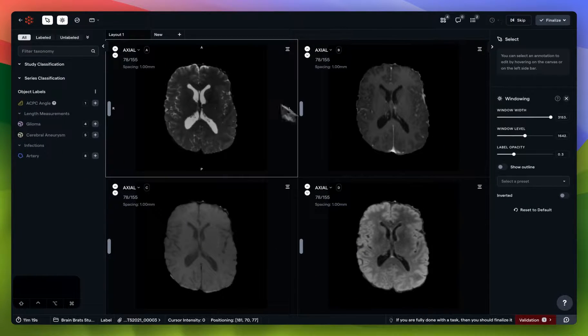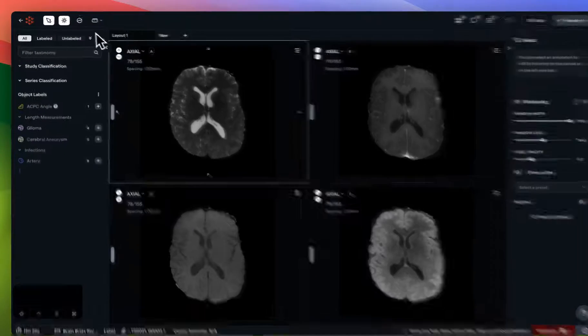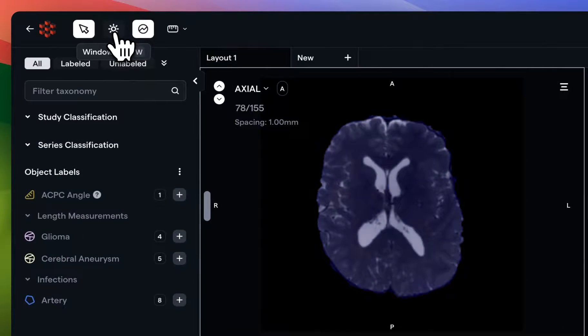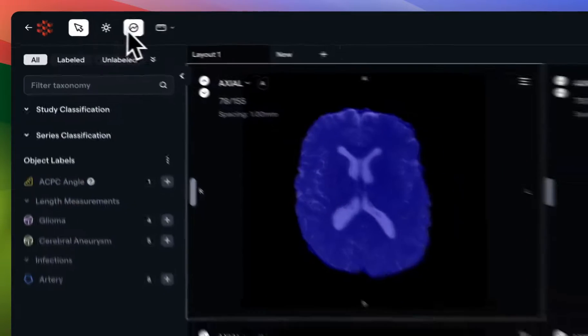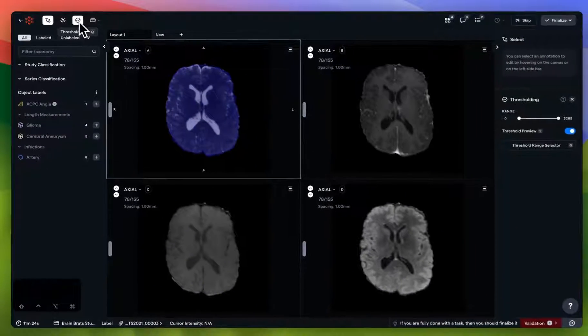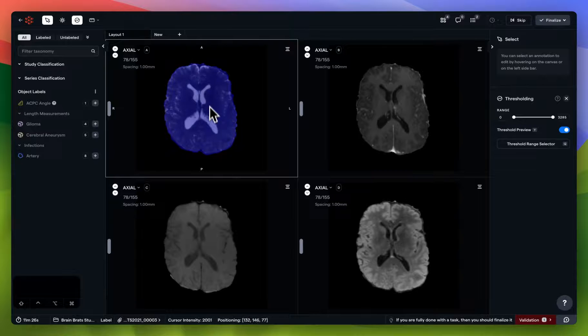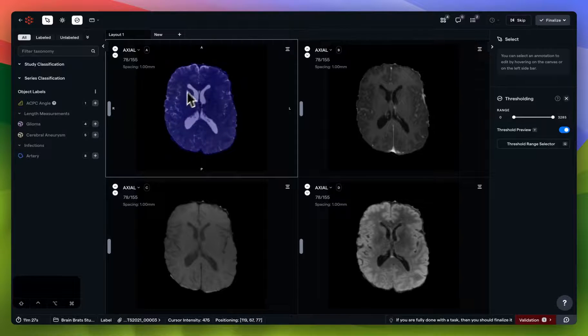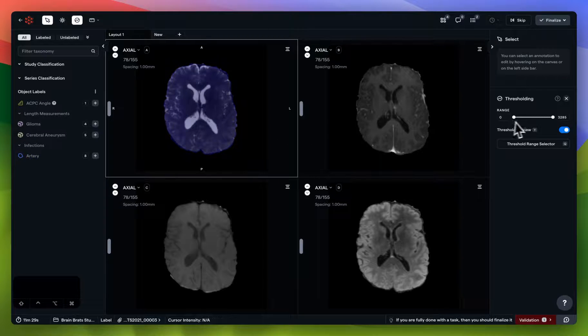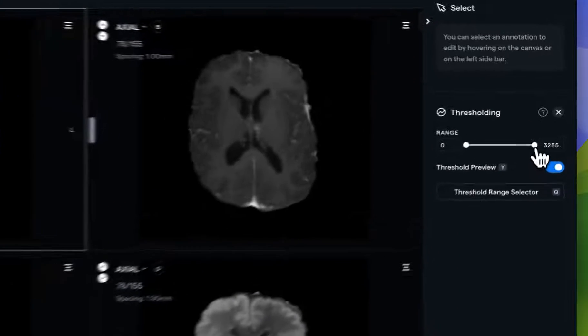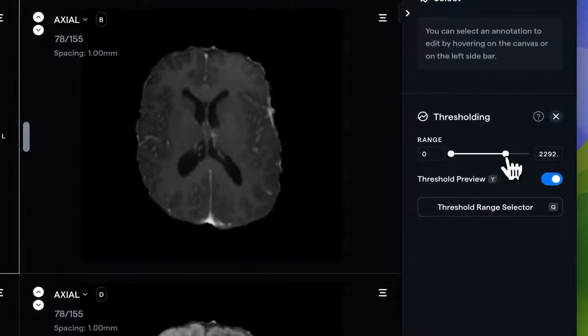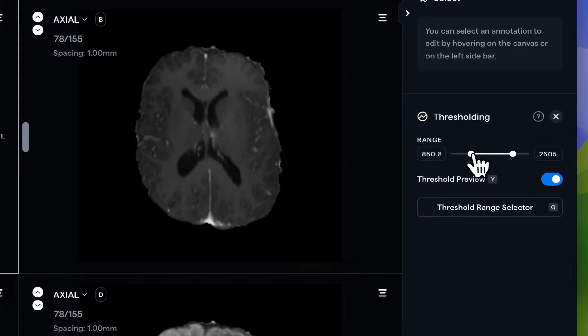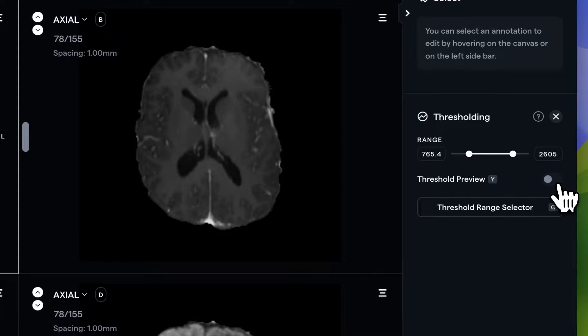Next up, we have thresholding settings. As you can see, clicking on the thresholding button enables the thresholding range for whatever viewport you currently have selected. This range can be controlled manually in the right-hand context panel, and you can also enable or disable the preview at any point in time.